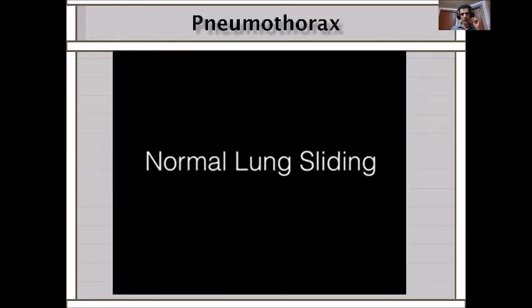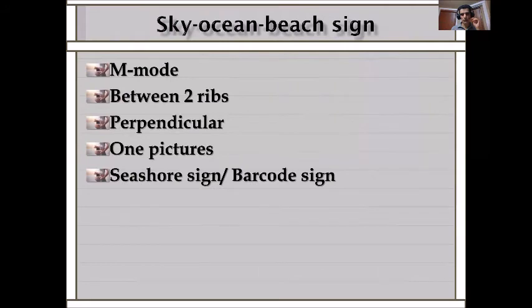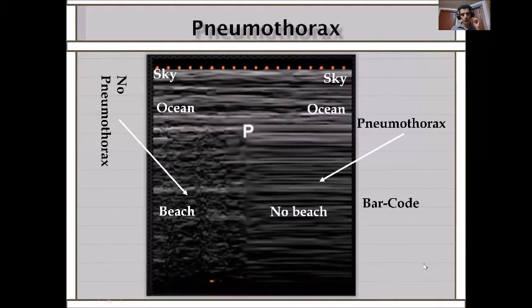I don't hear very clear, so I didn't understand the question. They're just asking, why are the ribs appearing black? Yeah, is it the shadow or is it the rib itself?